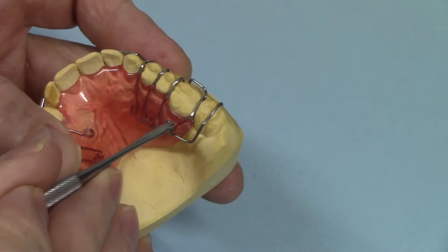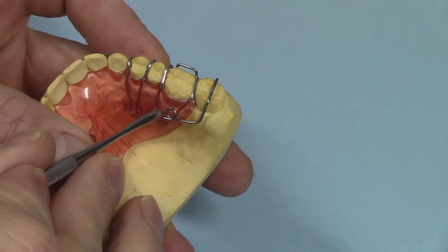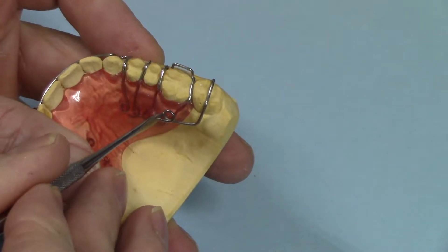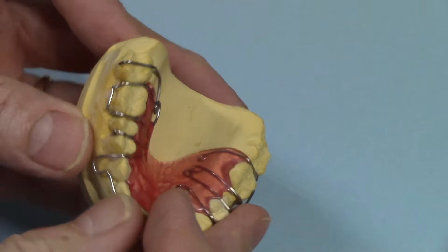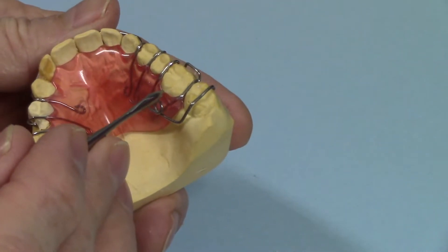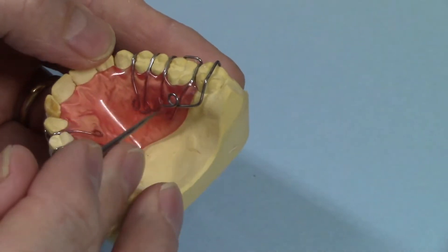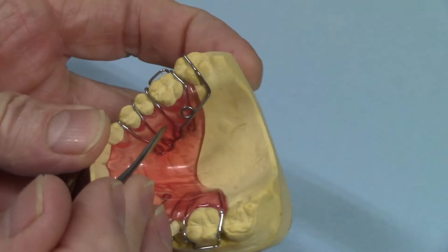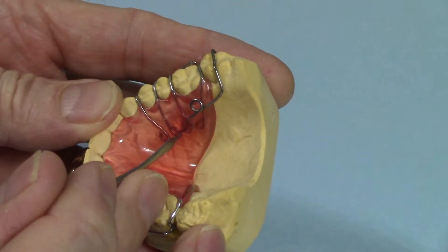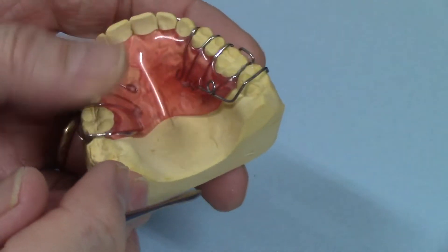I didn't want to cut the acrylic in some odd shape or bend the anchor bends of the Adams clasp in some odd shape just to position the distal of the acrylic. So I decided to lay the spring on top of the acrylic. I made the retainer first, finished it, then bent the spring to lay right on top. Then I cut a trough for the anchor bends, placed them in, mixed up some extra acrylic, filled it in, and finished it.